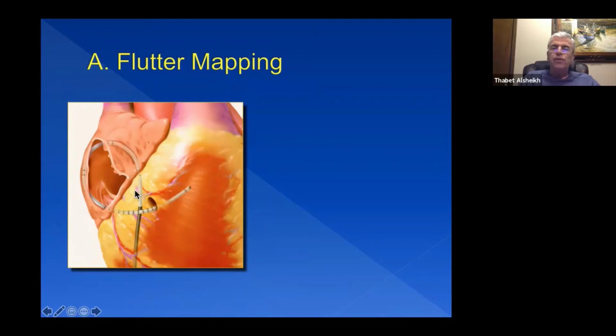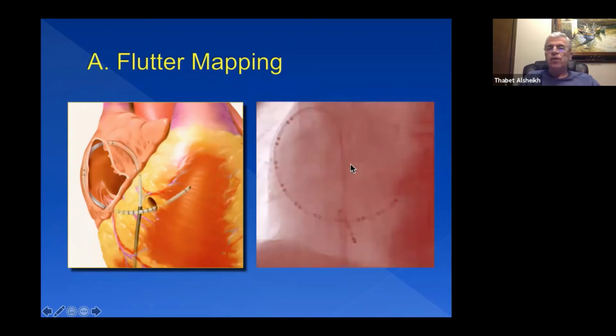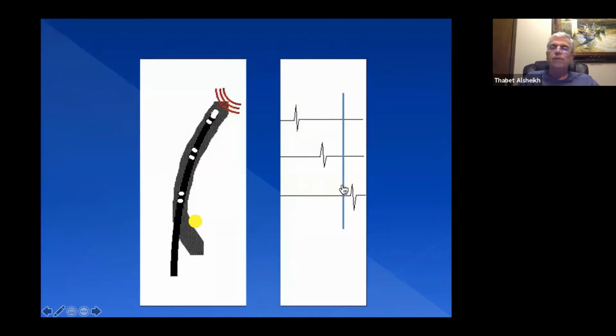in the coronary sinus. So you record the right atrium and the left atrium. And this is the duodeck in the right atrium, proximal poles, and the distal part in the coronary sinus. And this is, in this case, the ablation catheter actually. But let's see how we record atrial flutter and how we can tell, by figuring out the timing of recording, whether it's counterclockwise or clockwise.